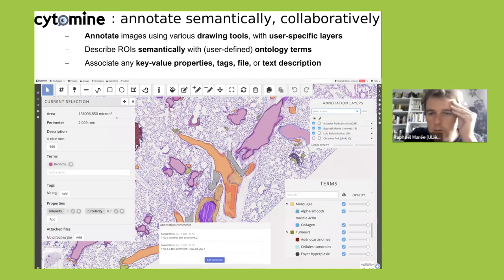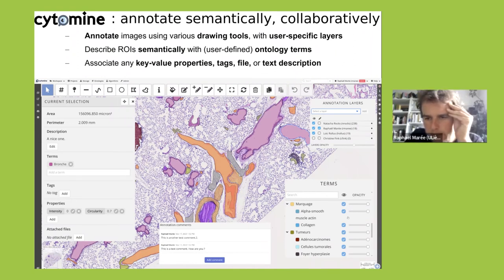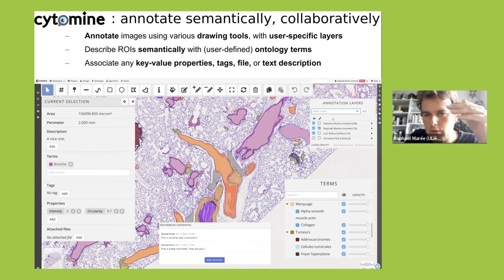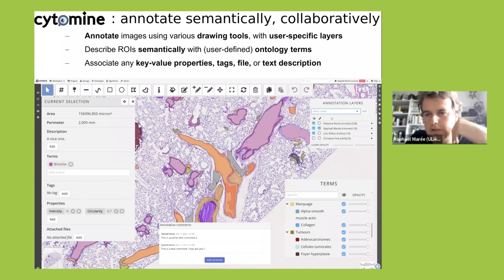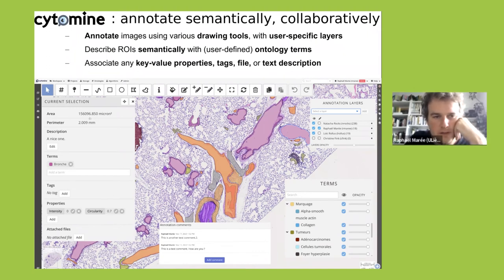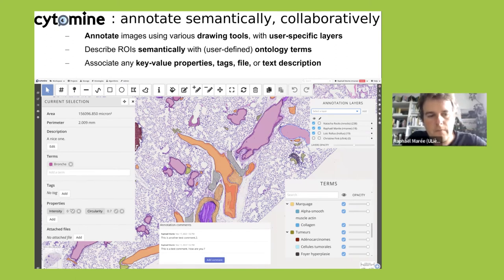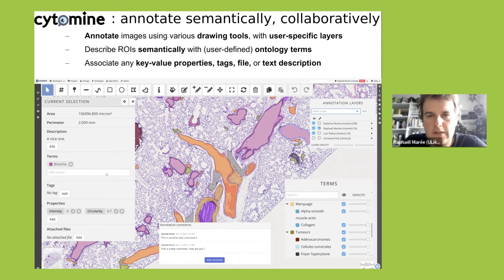You have multiple annotation layers from different users that you can activate or deactivate. In a collaborative project, you share them. When you select an annotation, you see different information. In addition to ontology terms, you can associate properties as key-value pairs, making it a very rich way to annotate images with a lot of structured information.